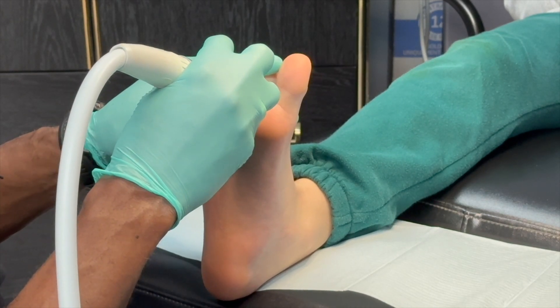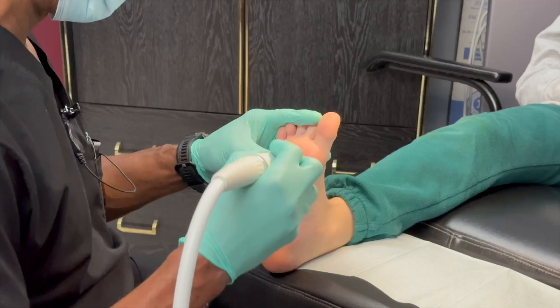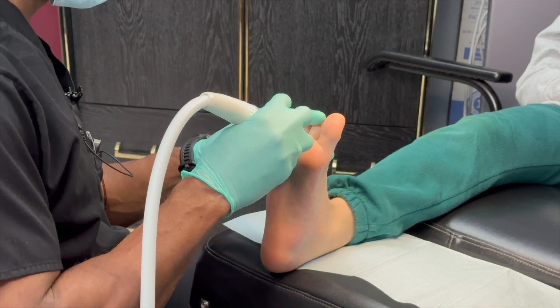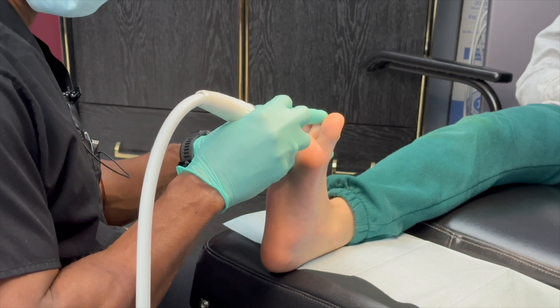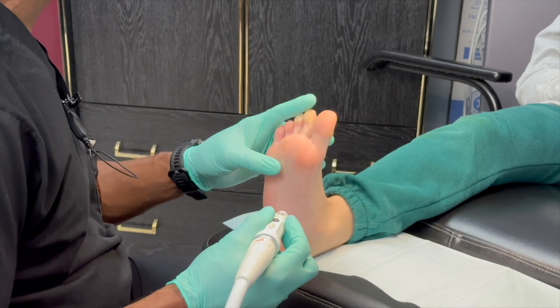The Swift isn't just fast and effective, it's also safe and precise. The technology targets only the affected tissue, leaving the healthy tissue around it untouched. There's no smoke, no smell, and no risk of infection from open wounds.